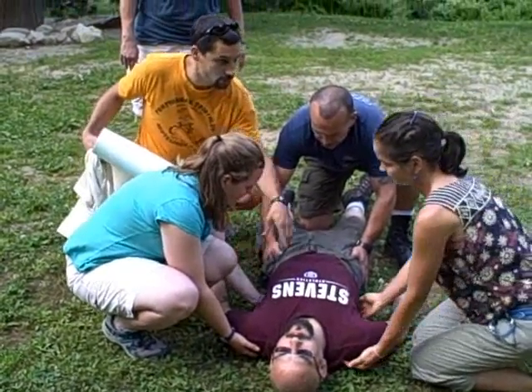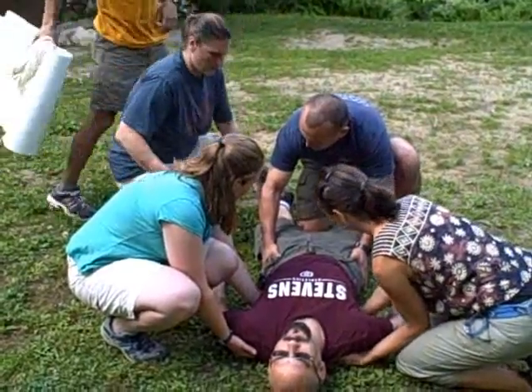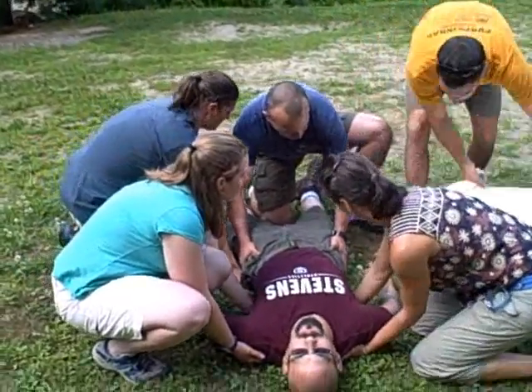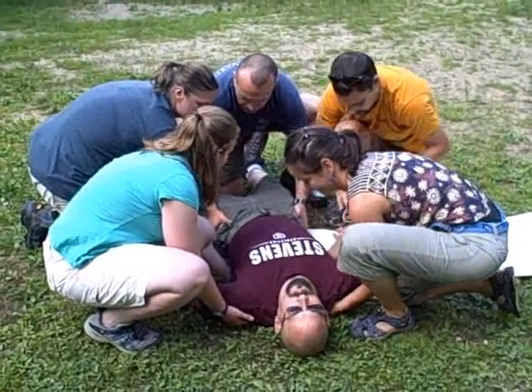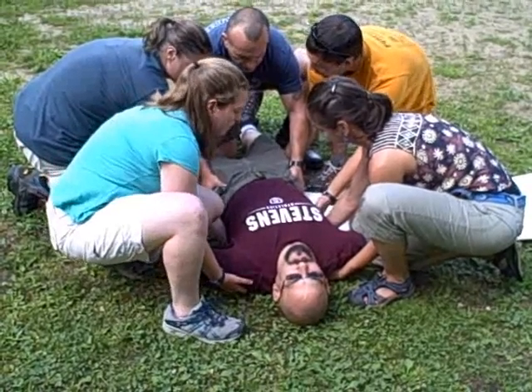Dana, if you get in on the torso here. Sarah, right here. Mimi, I'm going to have you come in on this side right here, and I'll take this side over here. Jerry, I'm just going to lift your arm up and put it on this pad right here. Ivan, since you're the one stabilizing the hips, we're going to go on your count.